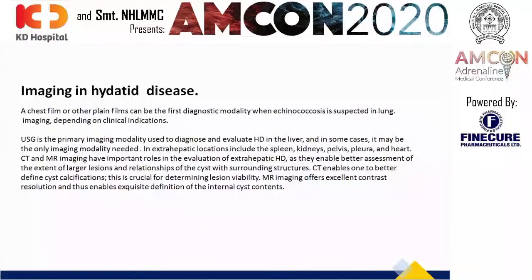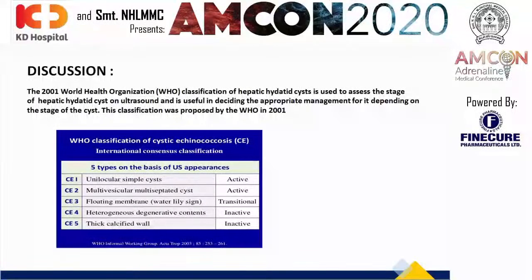CT enables one to better define cyst calcification. This is crucial for determining lesion viability. MR imaging often offers excellent contrast resolution and thus enables exquisite definition of the internal cyst contents. Next. Two minutes left.